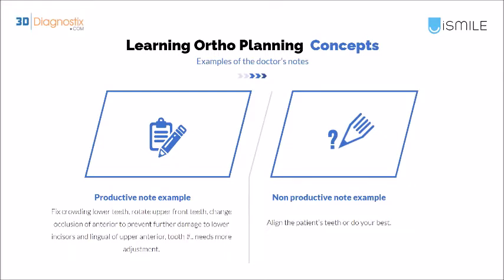However, a non-productive note can be like, please align the patient's teeth, or here's an aligner's case, please do your best. This is a non-productive note and will lead to a large number of aligners, as stated before.